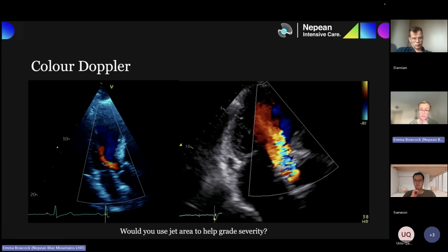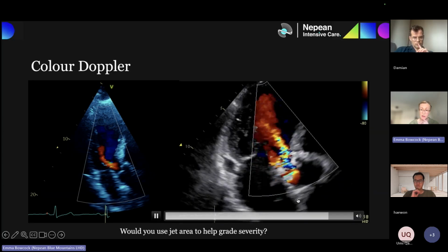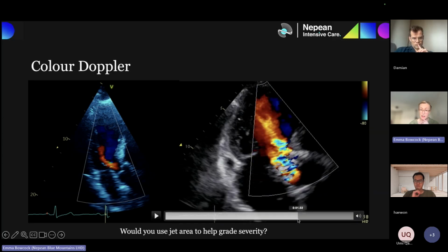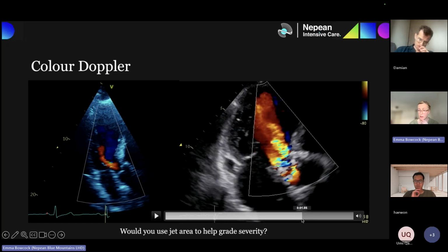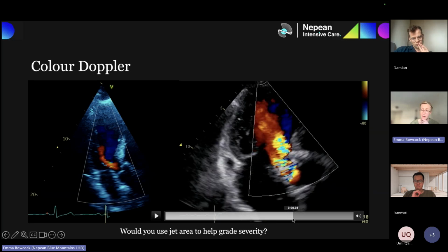Can you all see that? This part happening here, that Pisa dome forming. We've got what looks like a really broad vena contracta, even though we can't see it too well because of all the calcification and dropout that we're seeing. And yeah, a severe looking jet.